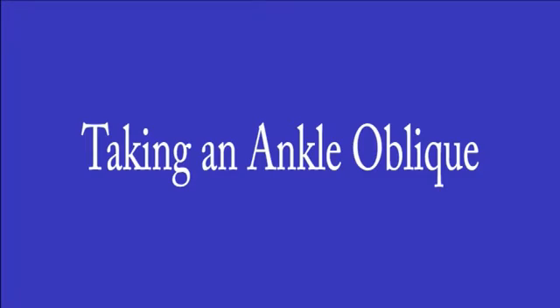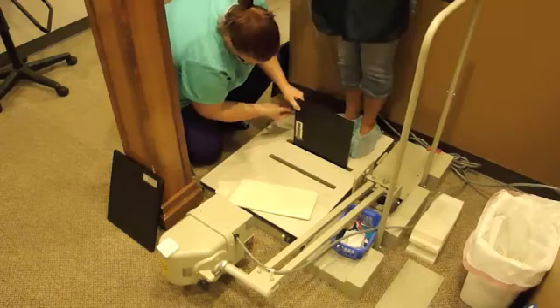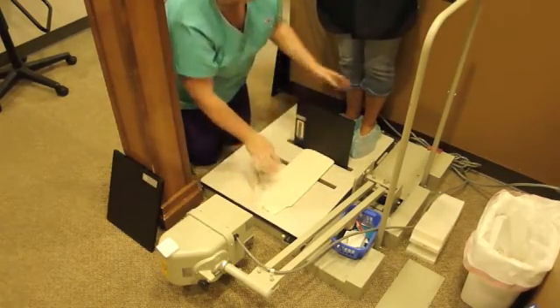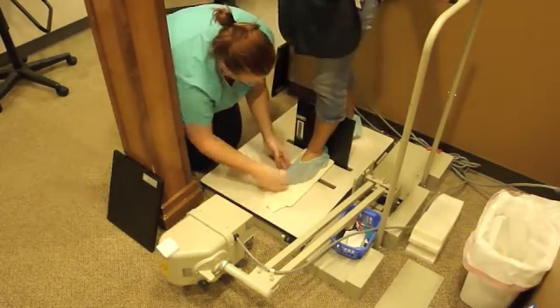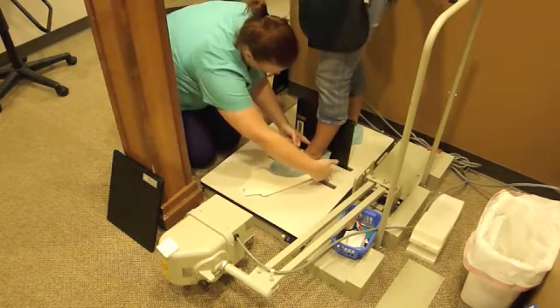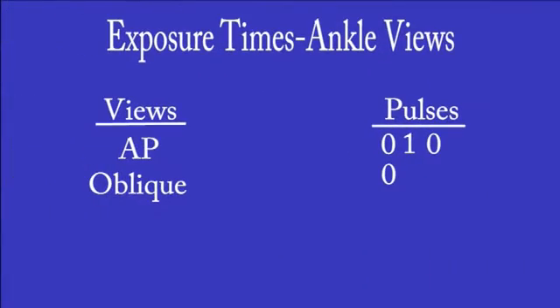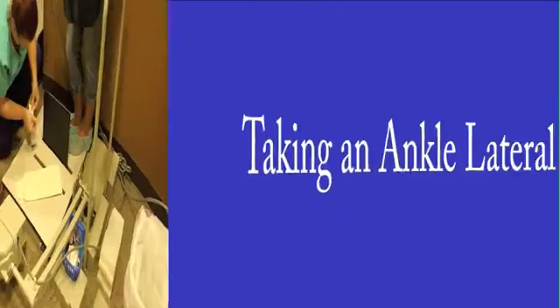To take an oblique ankle view, you will set the film and X-ray machine up exactly the same as the AP. The idea of an oblique is to open up the ankle joint and sinus tarsi so you can see a different angle. To accomplish this, you'll need to rotate the foot ever so slightly medially, or towards the big toe, so that the lateral and medial malleolus are exactly parallel with the cassette. You will then make sure to set the pulses at 0, 1, 0. Take the X-ray.